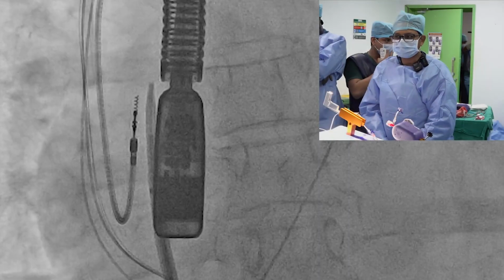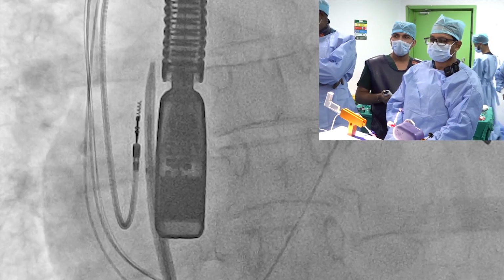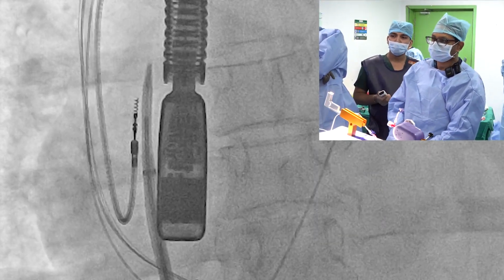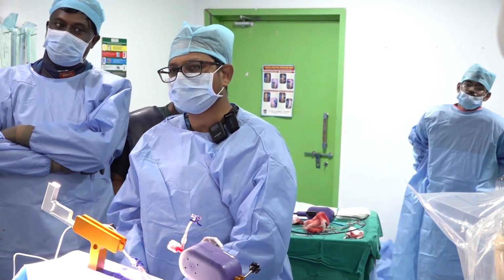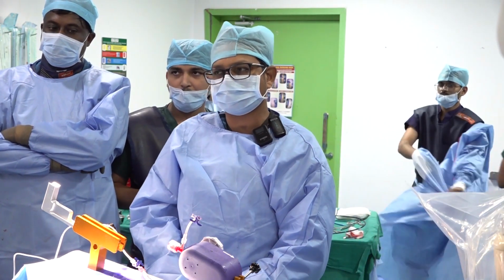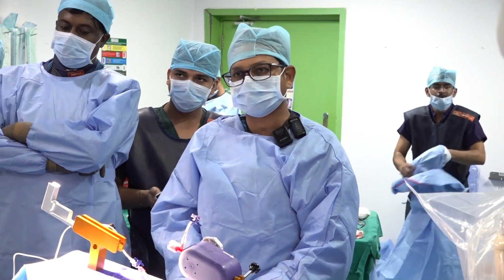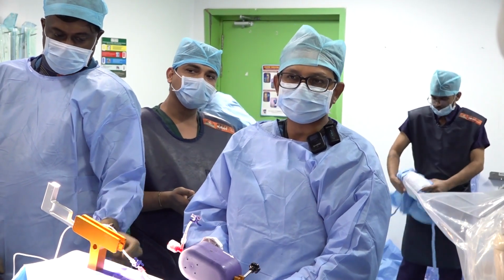So we started with the puncture. We took the SL1 sheath and the Brockenbrough needle, and we just saw the echo. In the bicaval view we are supposed to be mid to inferior, and in short axis we are supposed to be more posterior. So Dr. Hemant, can we see that echo?